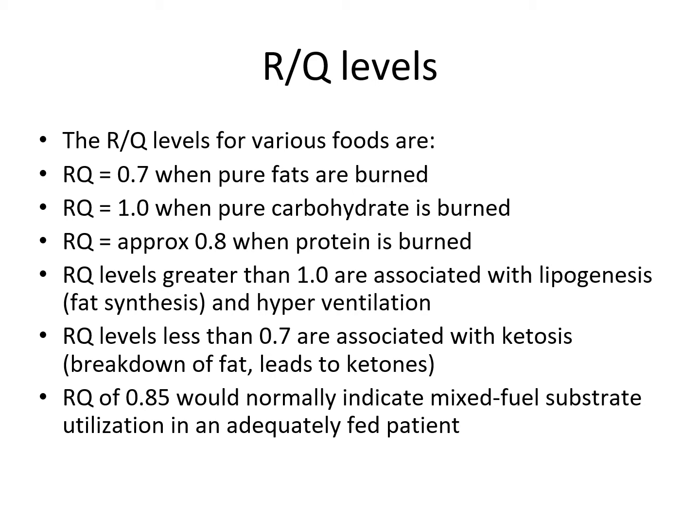So again, just like the last slide said, RQ levels greater than 1 are associated with fat synthesis, so we're forming fat, and hyperventilation. And I recall that being a question on your little quiz that comes up after this.